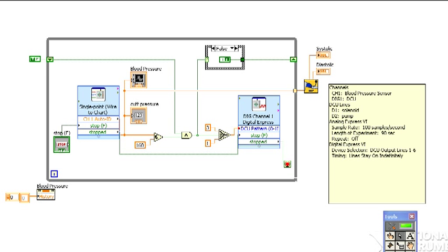While the blood pressure bleeds out of the cuff, let's take a look at the LabVIEW VI that's controlling the system. The main program is in a loop that runs during the entire data collection process. The Analog Express VI monitors the Vernier blood pressure sensor. The Digital Express VI controls the DCU to start and stop the pump and hold the solenoid valve closed.